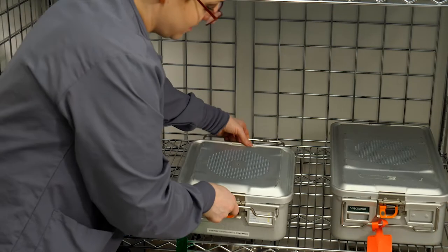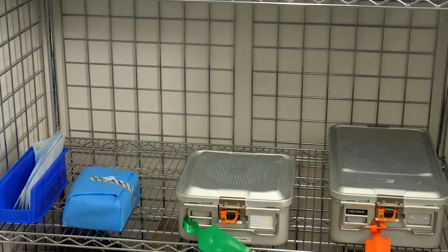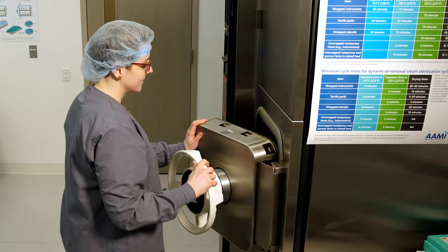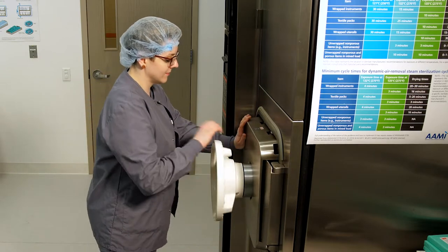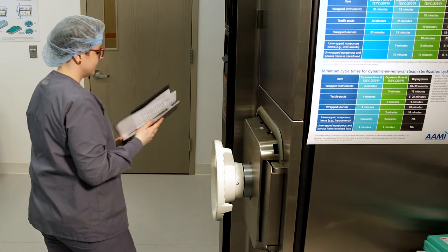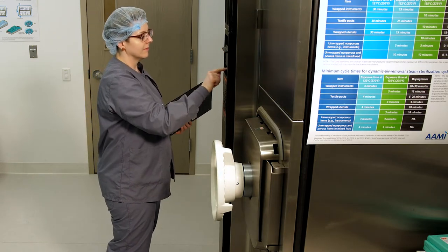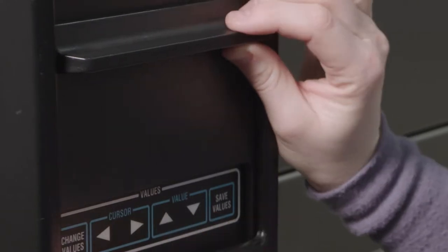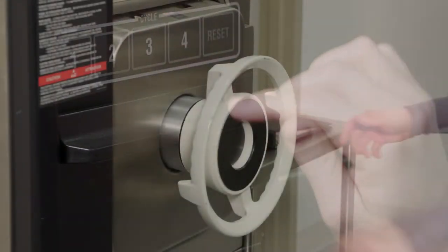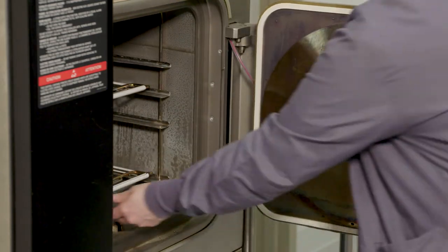After the instruments have been inspected and prepared in their sterile barrier on assembly, the SP Tech assigned to sterilization steps in. Sterilization is the removal of all bacterial and microbial life. The SP Tech uses the device's IFU to determine the parameters and type of sterilant required to achieve sterility. That's right, folks, there is more than one sterilization option.